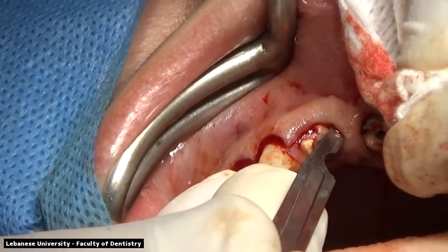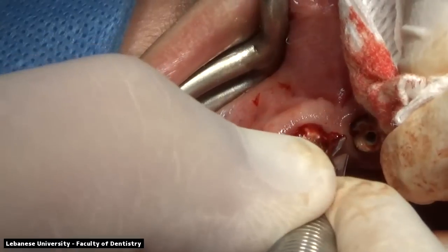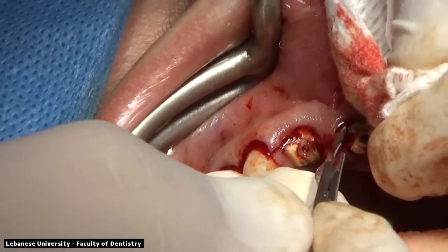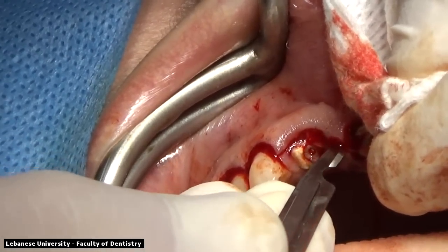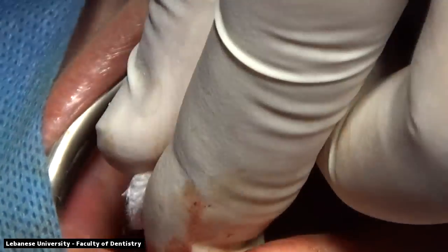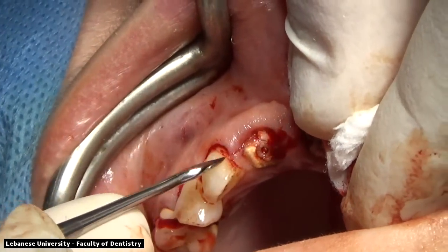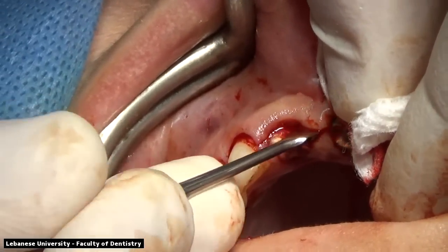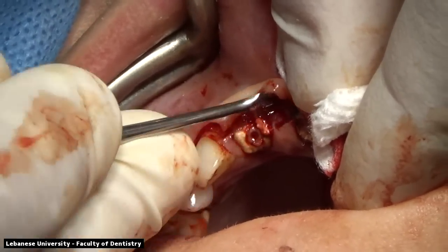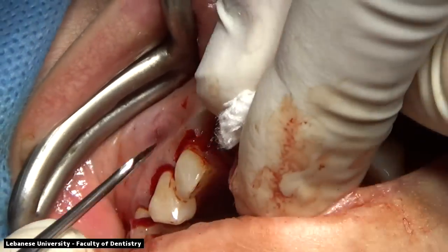With root canal treated teeth, endodontically treated teeth, we might have some scar formation or some fibrous tissue adhesions. So we're going back with our blade to make sure that we have clearance, and we're going all the way to the bone so that we can elevate a clean and full mucoperiosteal flap without any tearing or dehiscences to the periosteum. The periosteum in this case will act as a blood supply to our graft material or our implant that will be placed on the site, so it's very important to keep it intact.